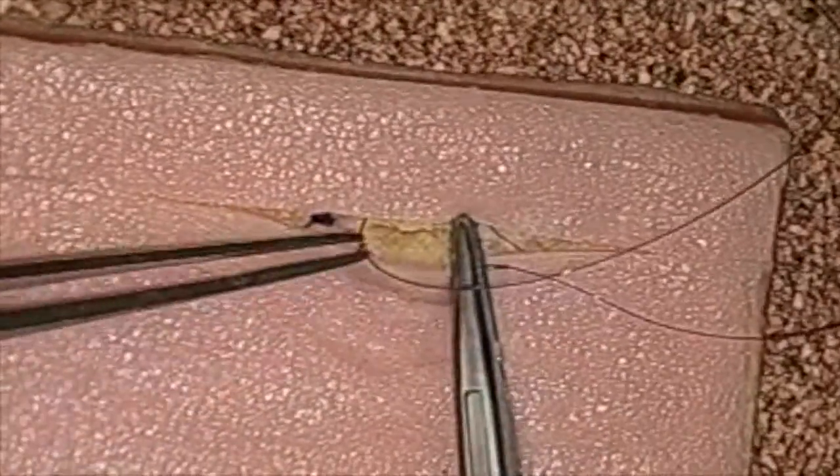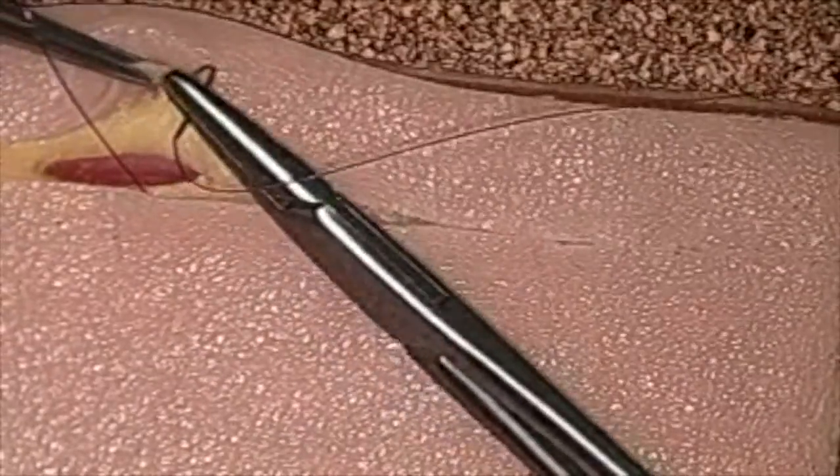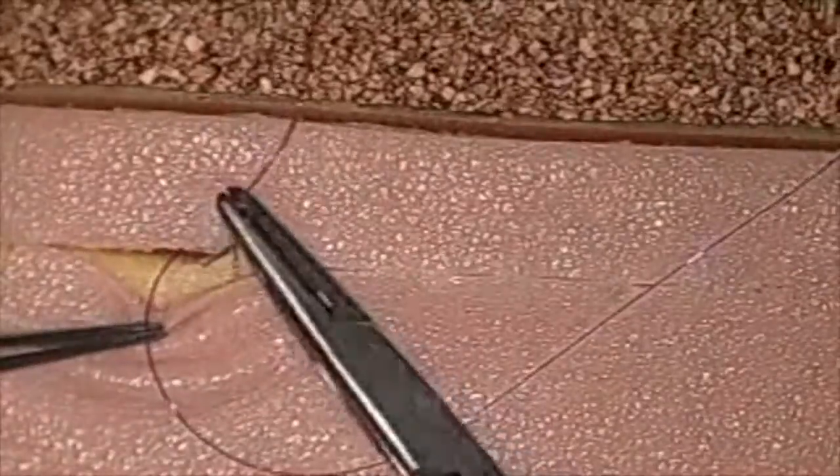It does oppose the tissue very nicely, so I want you to practice this especially for the live animal surgery. Notice after I take my bite, I have the needle come out and I grab it with the forceps. I want you to practice doing that over and over again — it's a very useful technique. Then for burying, you're going to first create your deep loop by doing superficial to deep and then deep to superficial. You can see here that's the deep loop.